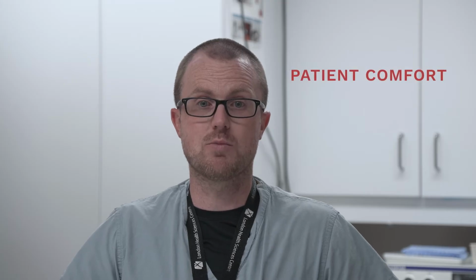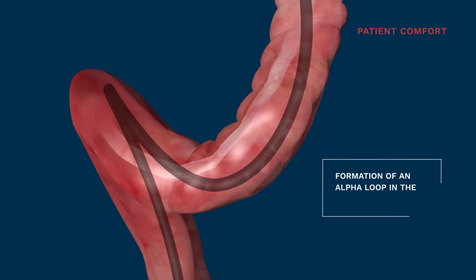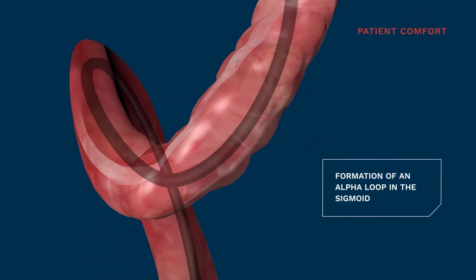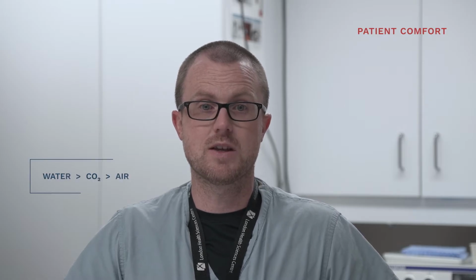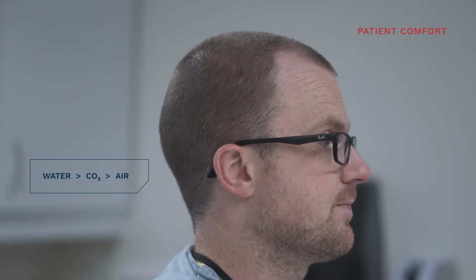Pain and discomfort is most frequently caused by longitudinal stretch on the mesentery, usually due to loop formation. Discomfort can also be precipitated by overdistension of the colon from excessive insufflation. CO2 is far better in this regard and should be considered the standard of care.